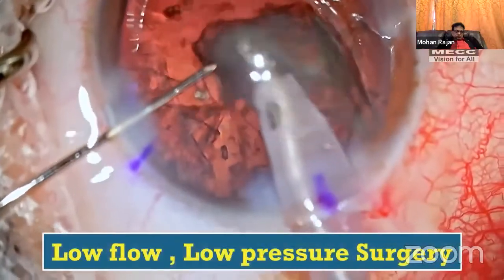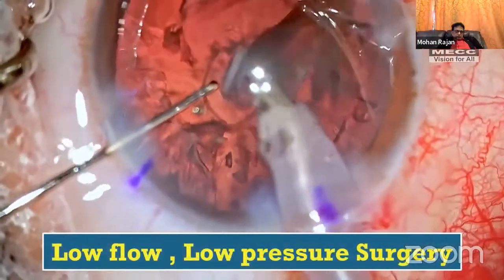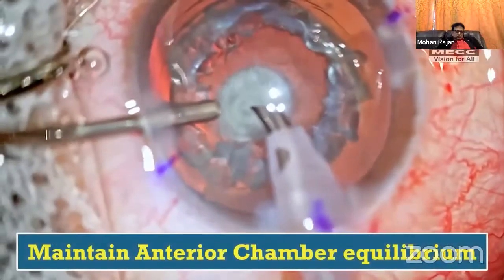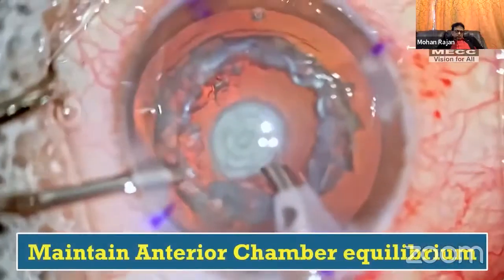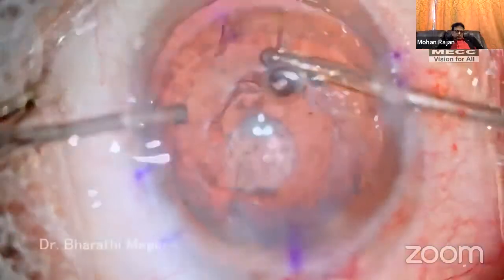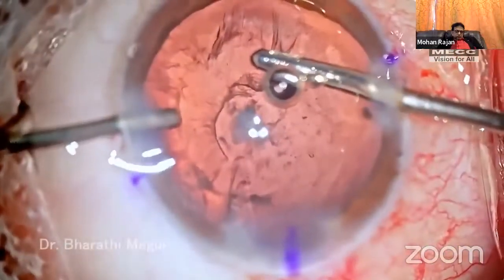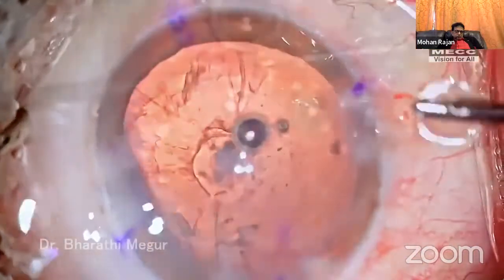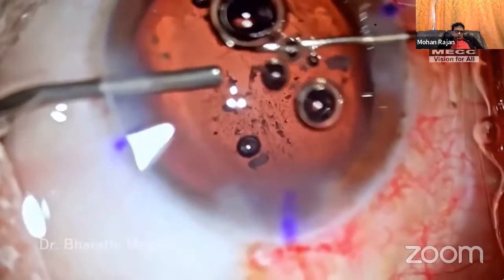The principles of low flow and low pressure surgery, along with maintained anterior chamber equilibrium, will allow us to achieve the goal of minimizing complications in such vulnerable eyes. Thank you. Wonderful surgery, Dr. Bharti. I think everything was done exactly the way it should be.